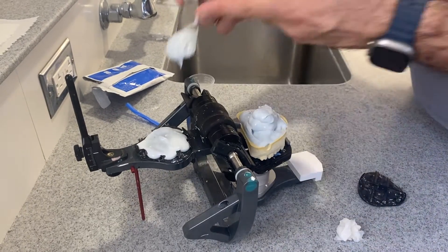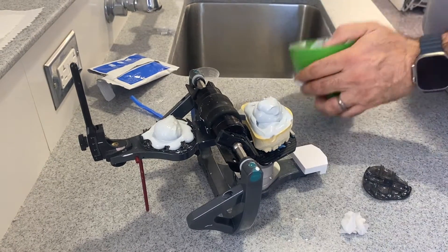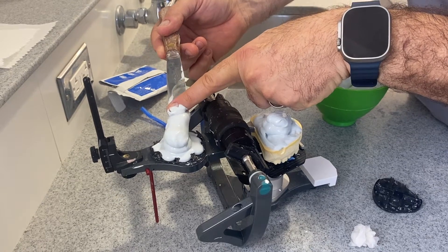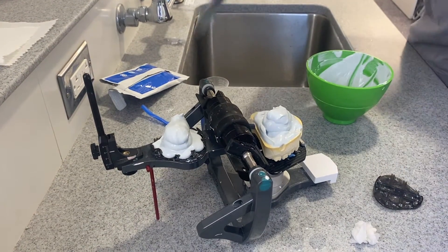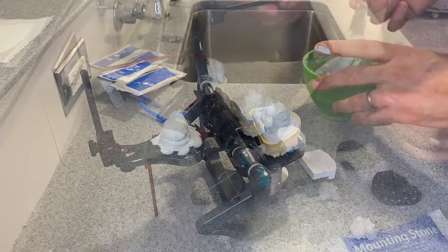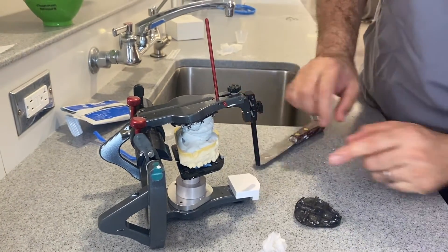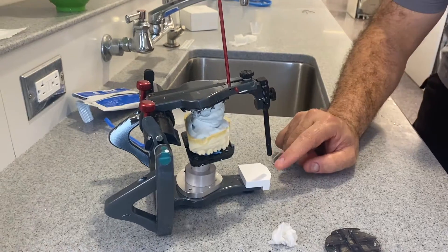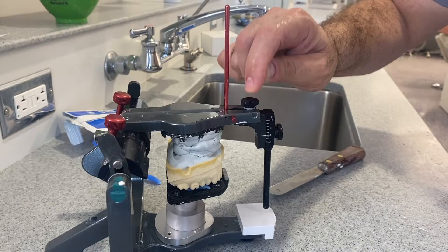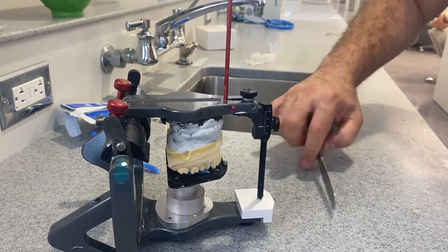Do the same thing on the other side. Press and push it and it stays in there. If that's not happening, just wait a little bit longer — you still have a lot of time. We're gonna close it down. As you close it down, you have to make sure the pin is at zero. Start pushing it, pushing it until the pin is at zero.